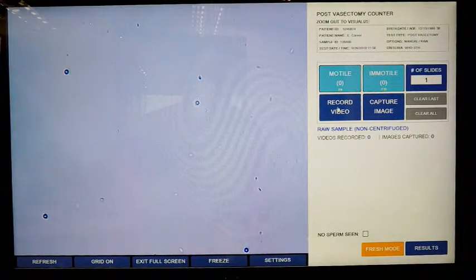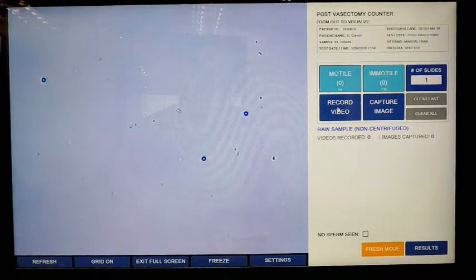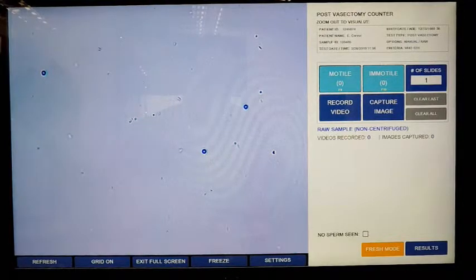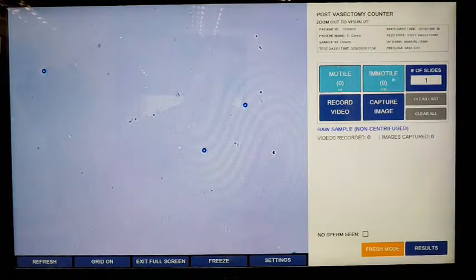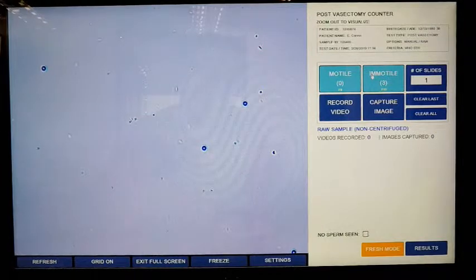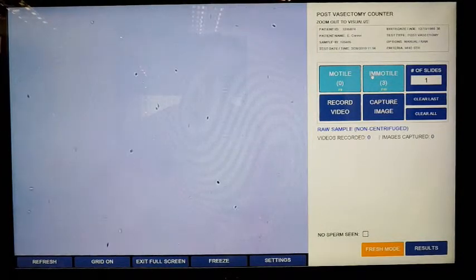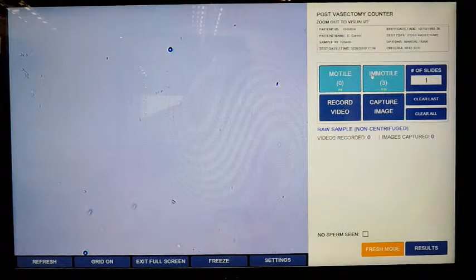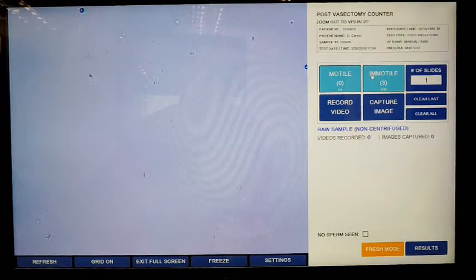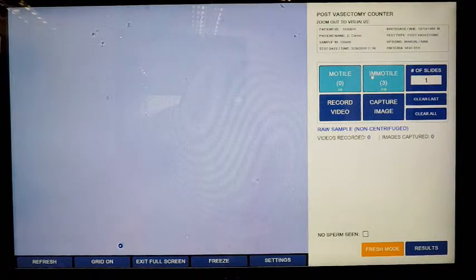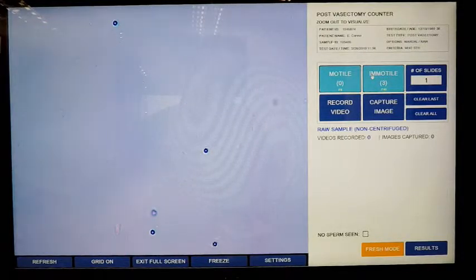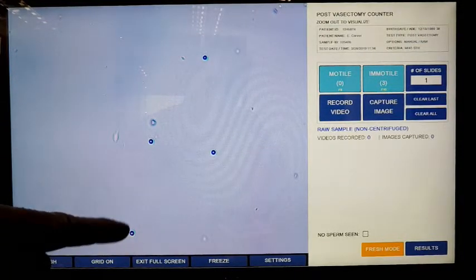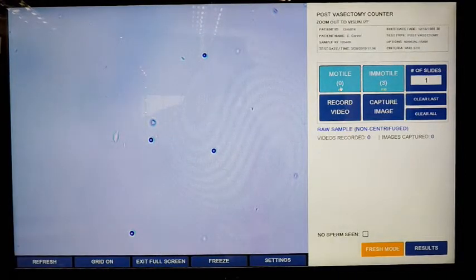So to demonstrate, I'm just going to start going through. For example, here in this field, I see three. So I'll just say immotile one, two, three, and just keep scanning through. All together, it takes maybe 60 to 90 seconds to get all the way through. The sperm really will jump out at you. They're not difficult to see when they are present. So we're seeing them as we go.